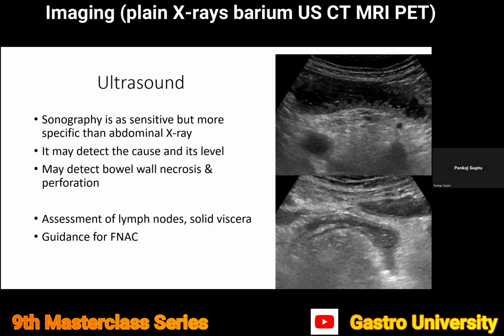Needless to say, ultrasound is a very useful tool for evaluation of lymph nodes as well as solid viscera, and it provides guidance for fine needle aspiration cytology or biopsy, which is frequently employed in the diagnosis of abdominal tuberculosis.